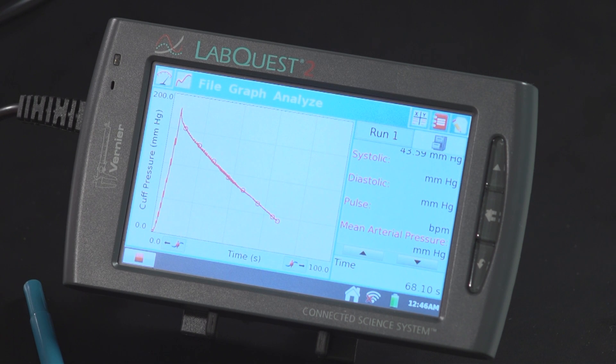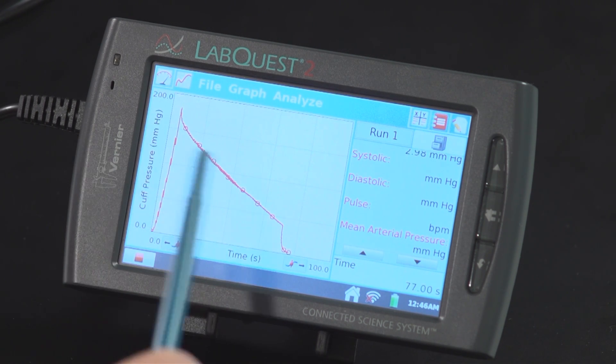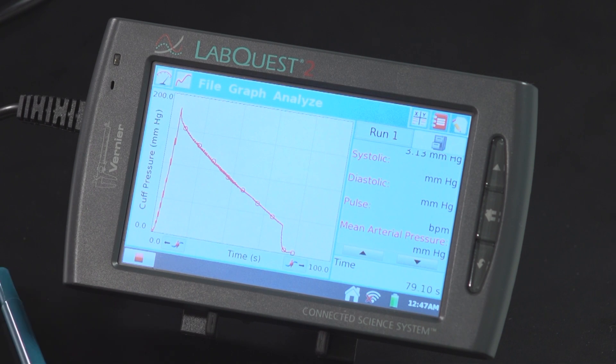Now that the cuff pressure is below 50 millimeters of mercury, I can release the pressure. You can see the pressure drop on the LabQuest screen — that's where I released the cuff pressure. But once again, don't stop data collection; let the LabQuest continue to collect data.